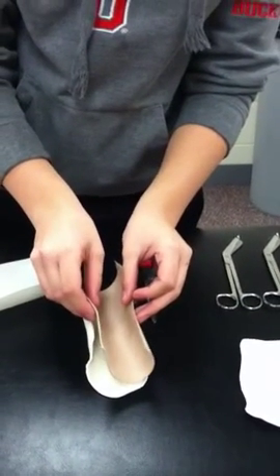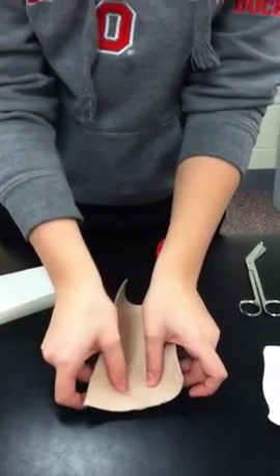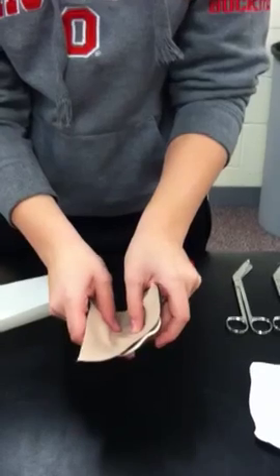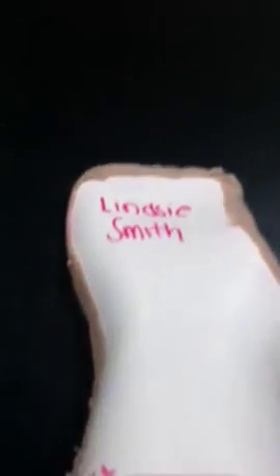You will manipulate it down inside the brace or the splint, and you will make all the edges smooth, and you'll pull it up over the edges, and your end product should look like one of these right here. As you can see, that's what goes on the patient, and then the edges are neatly folded over so that all your sharp edges and anything that might hurt the patient is covered up.